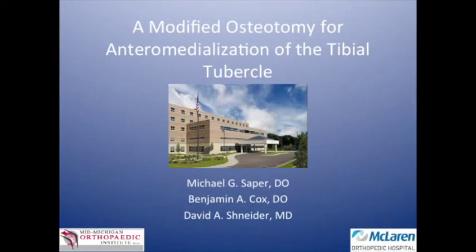This video demonstrates our technique of performing an anterior medialization osteotomy of the tibial tubercle.